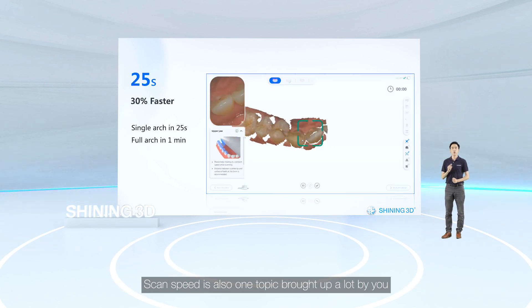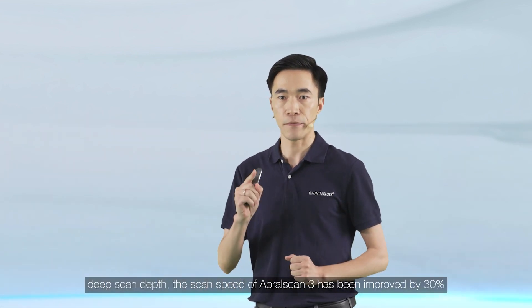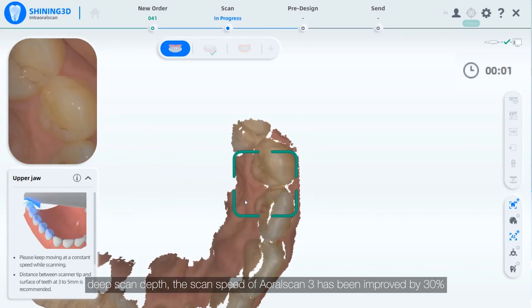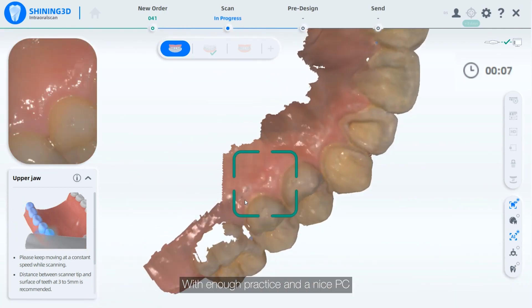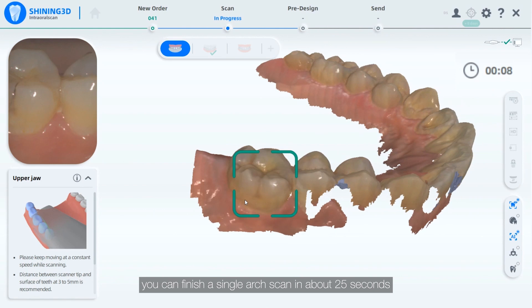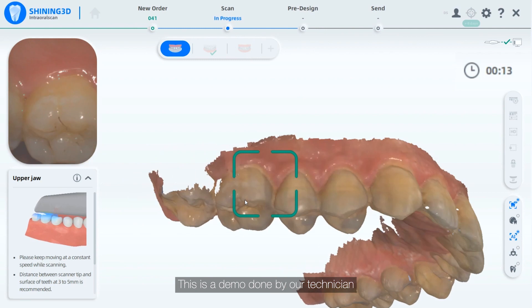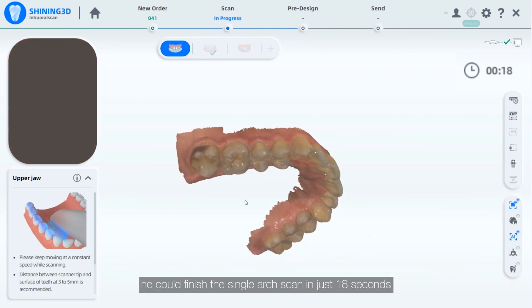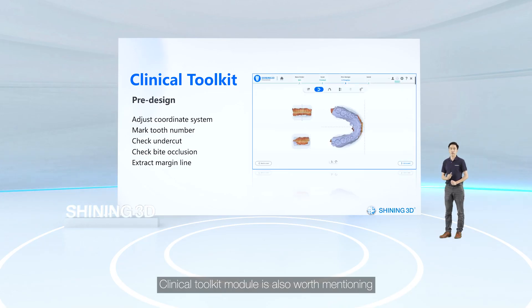Scan speed is also a frequently requested topic. Thanks to the enlarged scan field of view and deep scan depth, the scan speed of Aoralscan 3 has been improved by 30 percent. With enough practice and a capable PC, you can finish a single arch scan in about 25 seconds — one demo by our technician was completed in just 18 seconds.